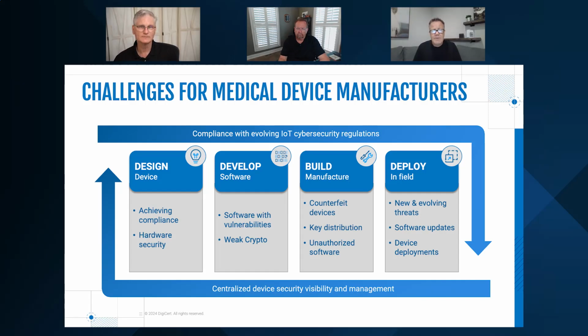Yeah, they really cover the whole life cycle of the device. Consumer companies historically could get away with putting out a device and never updating it. It goes into your house and it controls some light bulbs. Medical device companies could never do that. They're on the hook for the entire life cycle of that device, and that could be 5, 10, 15 years. So everything from the design phase, where they have to think about the hardware, the compliance, the certifications, and the hardware security, if there's any.